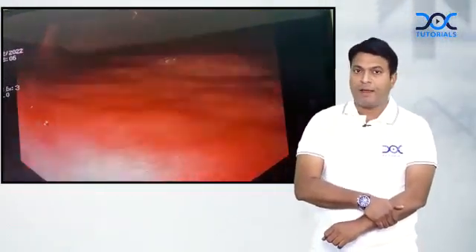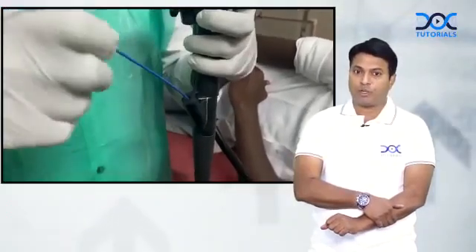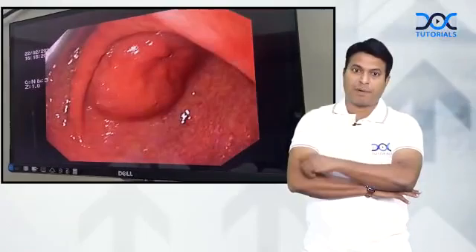What I am going to do now is pass a biopsy forceps into the endoscope and do an invasive investigation to test for H. pylori. You can see I am passing the biopsy forceps and I am going to take random tissues from the stomach — a tissue punch from the stomach.